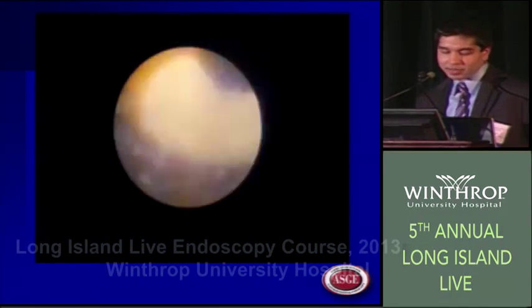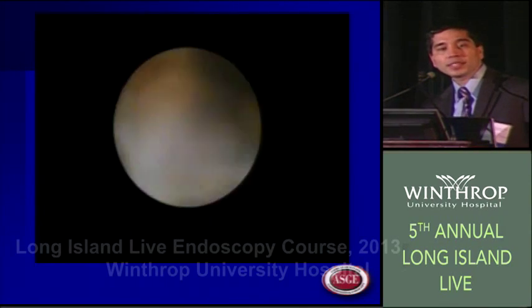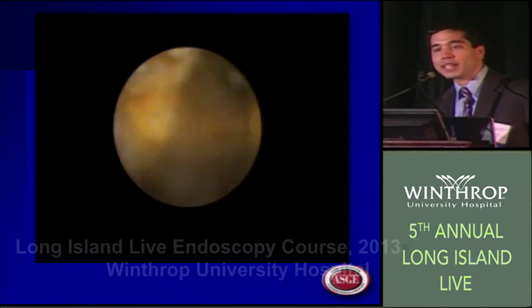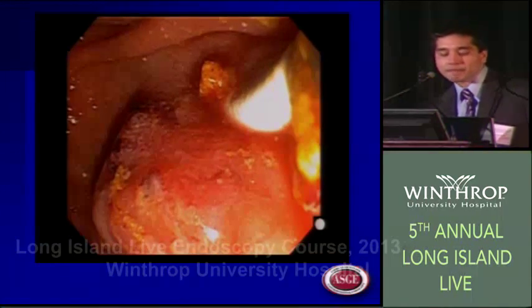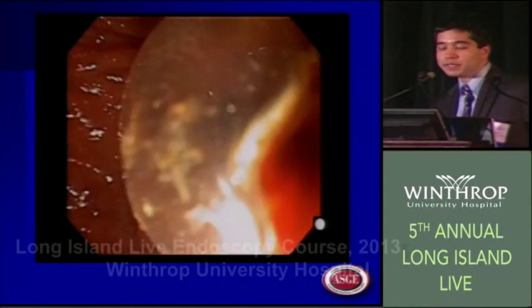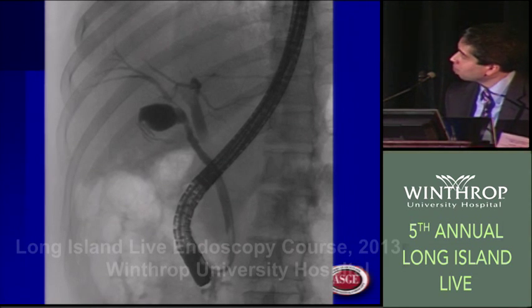And then subsequently, intraductal lithotripsy is performed with EHL, electrohydraulic lithotripsy. If you're not familiar with the technology, there are two electrodes, and energy is transmitted to the electrodes. It creates a spark gap between the two electrodes, and that, through an aqueous medium, will transmit shock waves to allow breakage of stones. In this case, this was the first session of intraductal lithotripsy. She went on to a second session, and then just this past Monday, I did her last ERCP, and you can see a difference in the missing stone here.